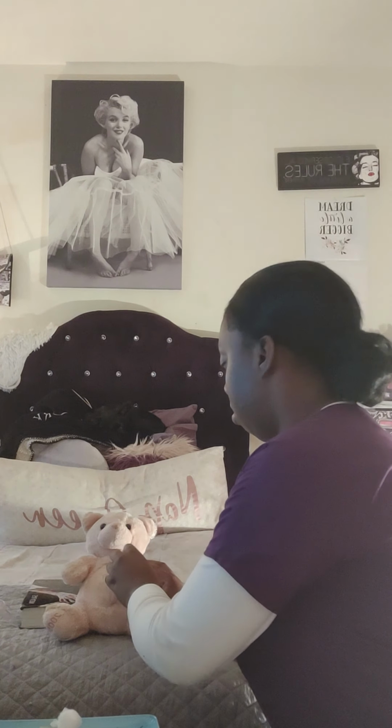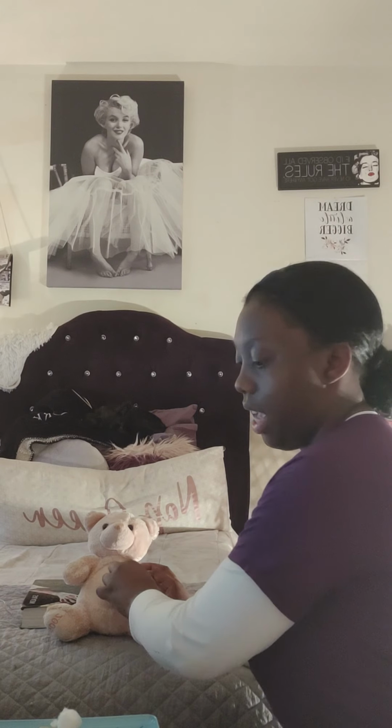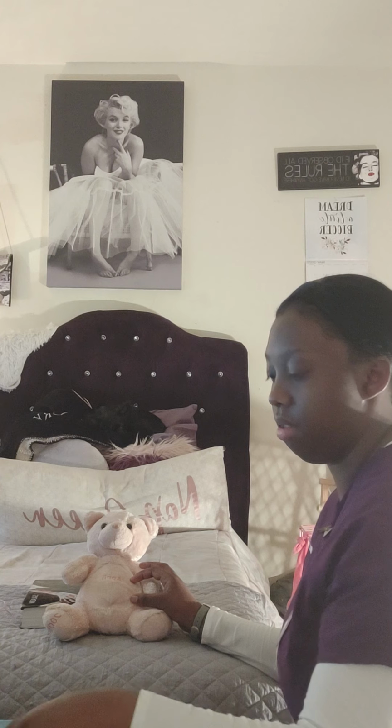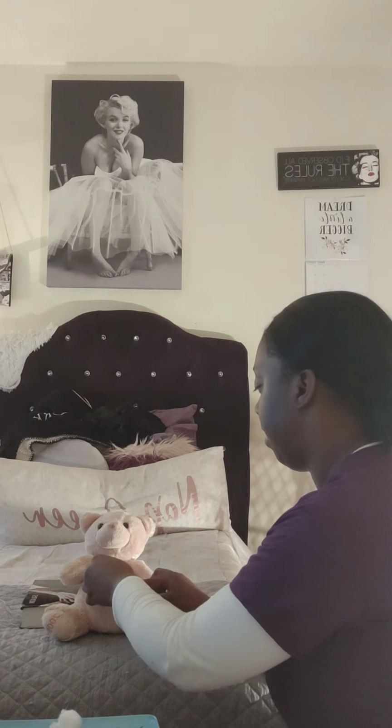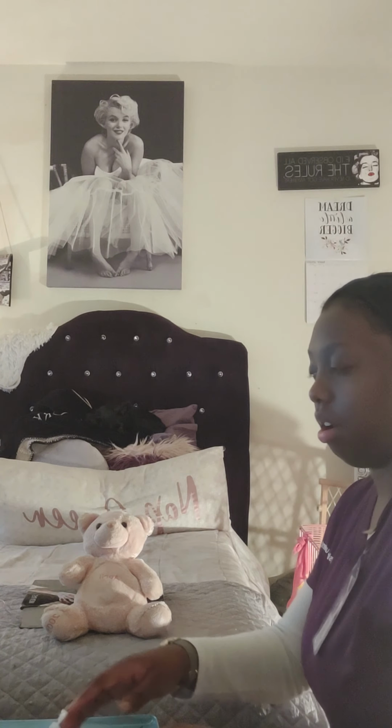Use a cotton or gauze to wipe the site. Activate the safety device. And then apply the Band-Aid if it's needed.